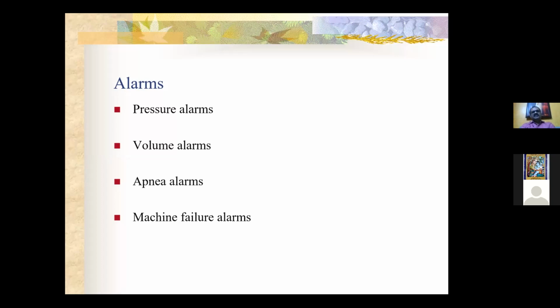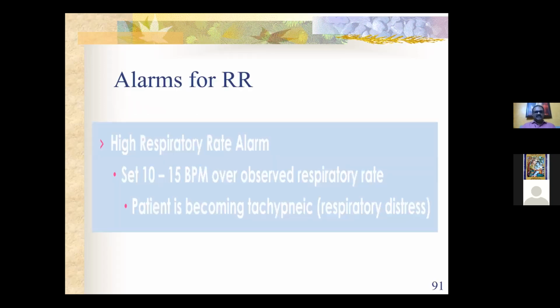So in those cases, in pressure control ventilation, we'll be setting the volume alarms. And in pressure support ventilation, we'll be setting up the apnea alarms. And in any case, there will be machine failure alarms, a lot of things which I'm not going into the details. So basically, we're going to set all these things.